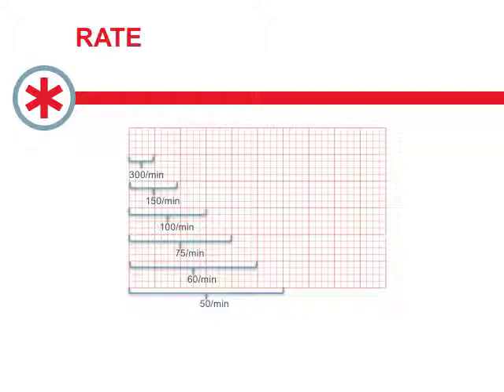This just takes a little memorization. If you take each of those 5 little block squares, or one big square, and you just count how many big squares there are. If you have one big square between your QRS complexes, you're running at 300 beats a minute. If it's 2 squares, it's 150 beats a minute. 3 squares is 100. 4 squares is 75. 5 squares is 60. And 6 squares is 50. And then as you go below that, you enter the 40s and the like, which at that point I'm okay with. So it's really just a quick way to eyeball what your ventricular rate is. And between what the ECG prints out and a quick eyeball of this, that's about all I actually ever use.